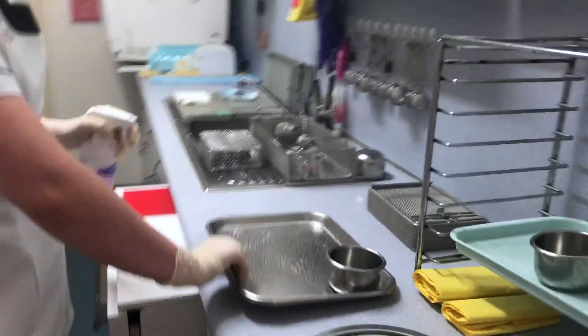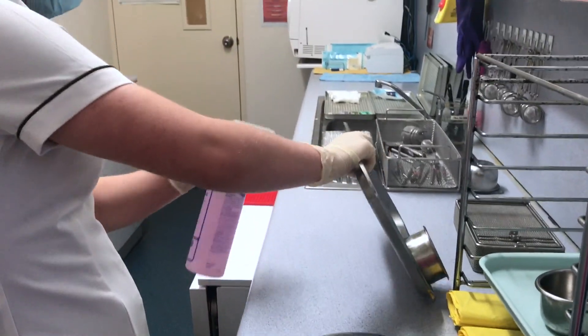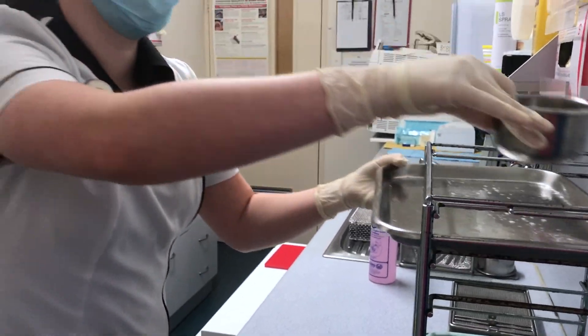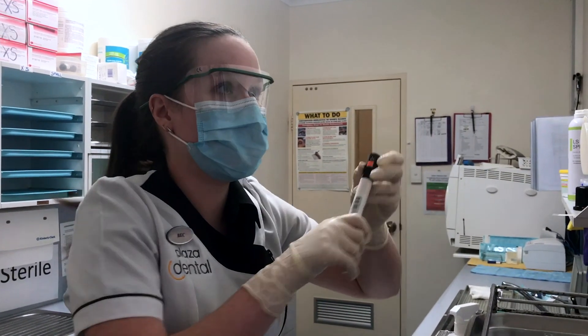When we're finished, we remove our tray cover, spray our bowl, and then pop our trays up just to sit for a minimum of 10 minutes.